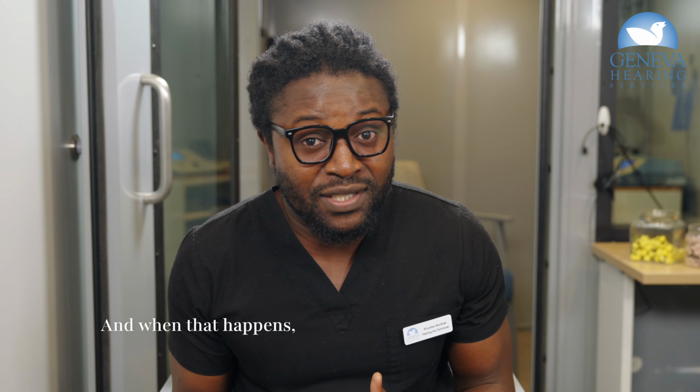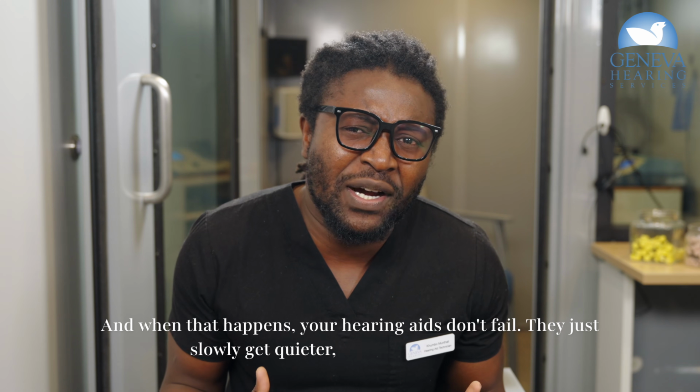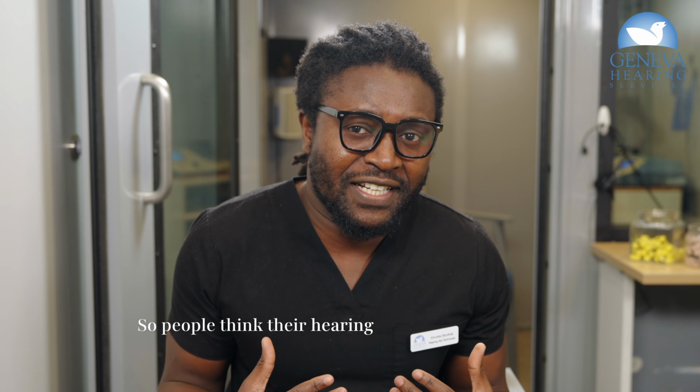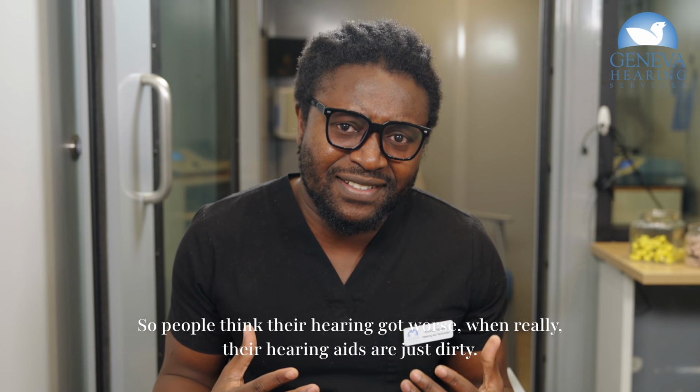And when that happens, your hearing aids don't fail. They just slowly get quieter, duller, and less clear. So people think their hearing got worse when really their hearing aids are just dirty.